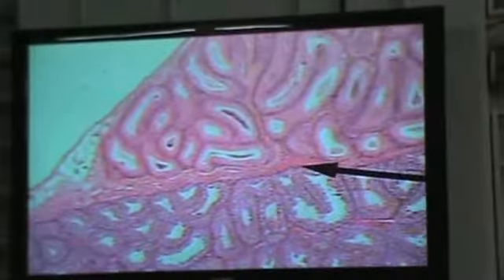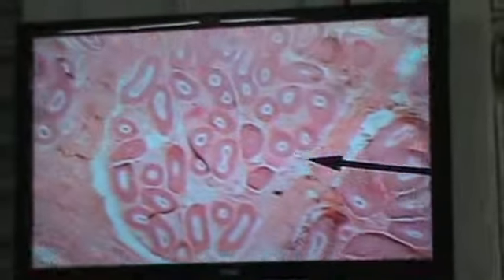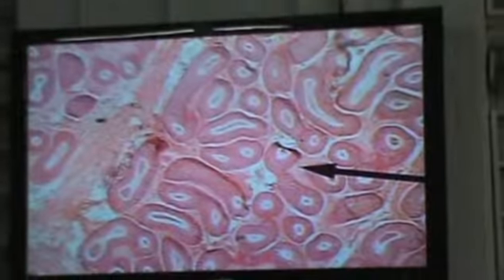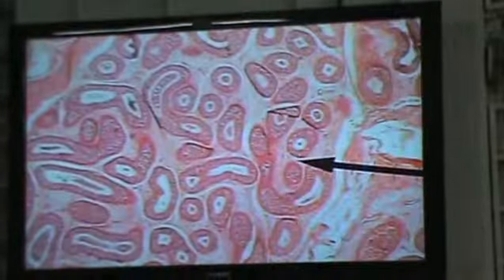Okay, so in some cases you see the septulae testis very well. Let's just look at this slide right here. Depending on the direction in which the testis is cut, you can see the septulae. So here you can see in this testis right here, the septulae testis are very, very prominent. Okay, so the testis has what I refer to as the septulae testis within. It depends on the animal that you're looking at.